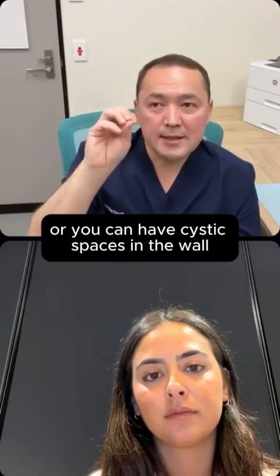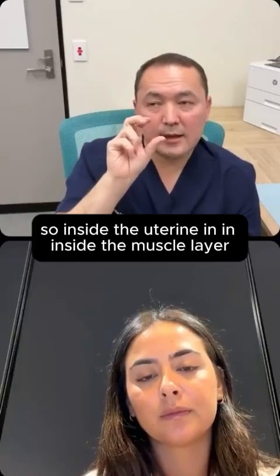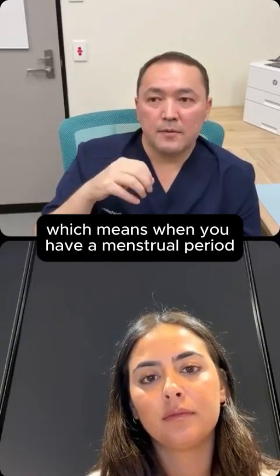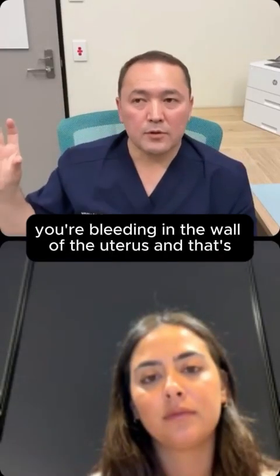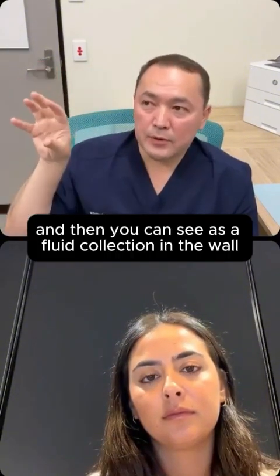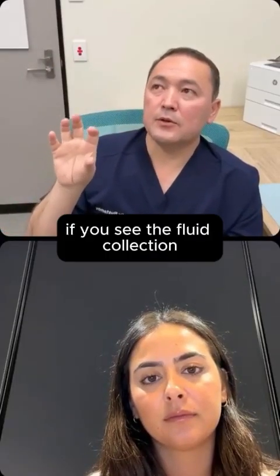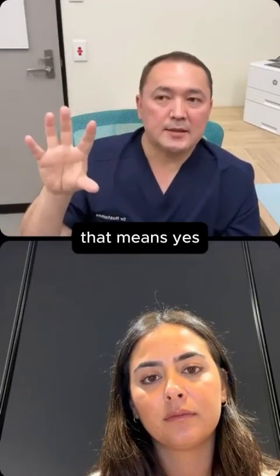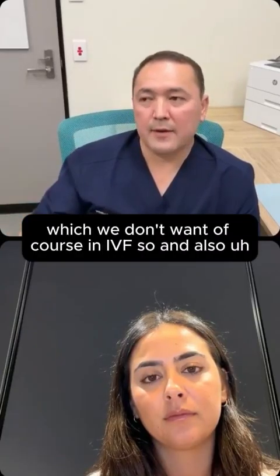Or you can have cystic spaces in the wall, inside the muscle layer of the uterus. That's another sign of adenomyosis, which means when you have a menstrual period, when you bleed outside, you're bleeding in the wall of the uterus, and that blood is getting stuck, and then you can see it as a fluid collection in the wall. Anywhere you see a fluid collection, we call it a cyst. So if you have a lot of cystic spaces, that means yes, there is adenomyosis growing in the wall, which we don't want, of course, in IVF.